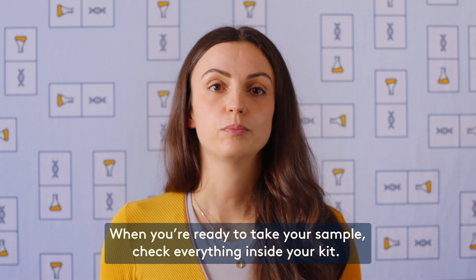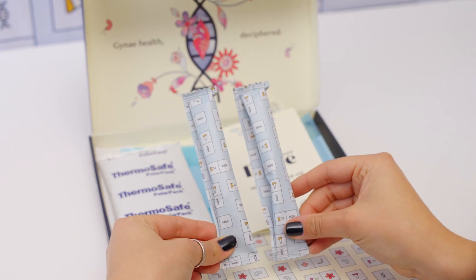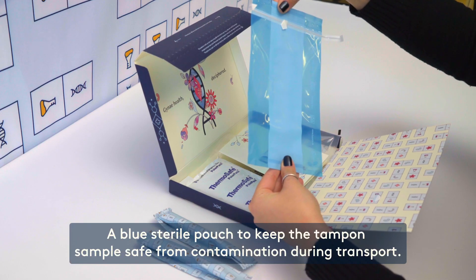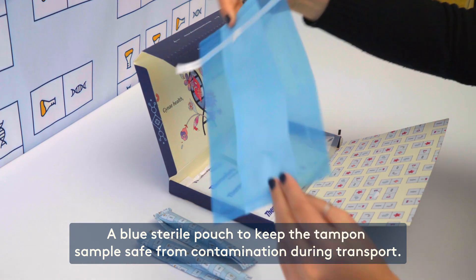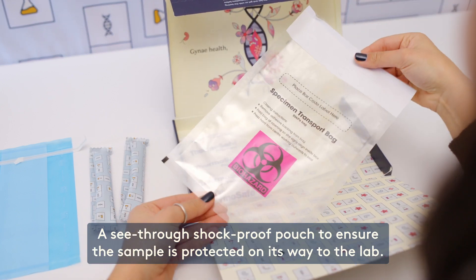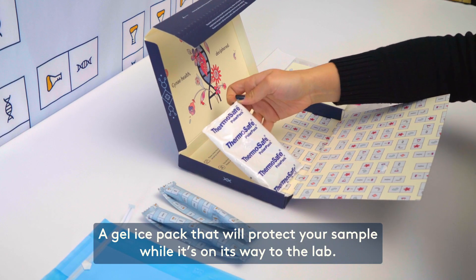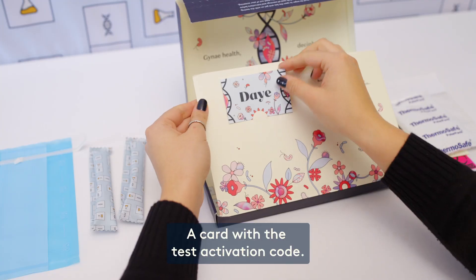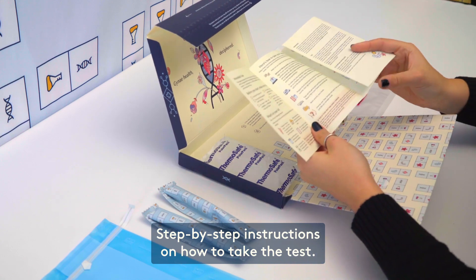When you're ready to take your sample, check everything inside your kit. Here's what it should include: two sterile tampons to take your sample — you only need one, but a second one is there for backup. A blue sterile pouch to keep the tampon sample safe from contamination during transport. A see-through shock-proof pouch to ensure the sample is protected on its way to the lab. A gel ice pack that will keep your sample cool while it's on its way to the lab. A card with the test activation code, and step-by-step instructions on how to take the test.